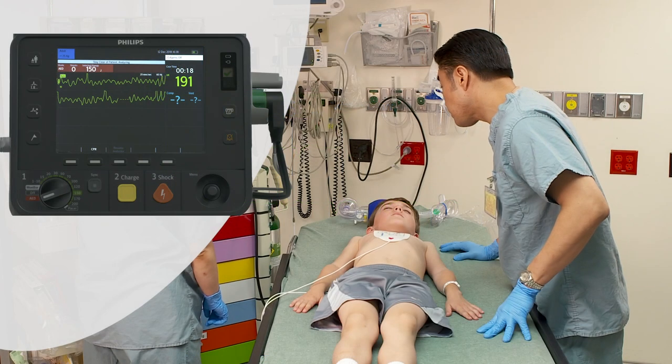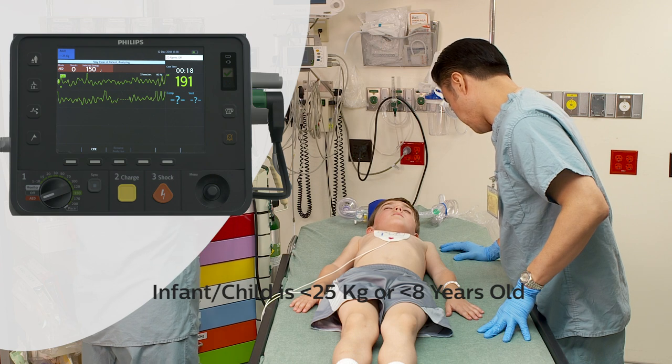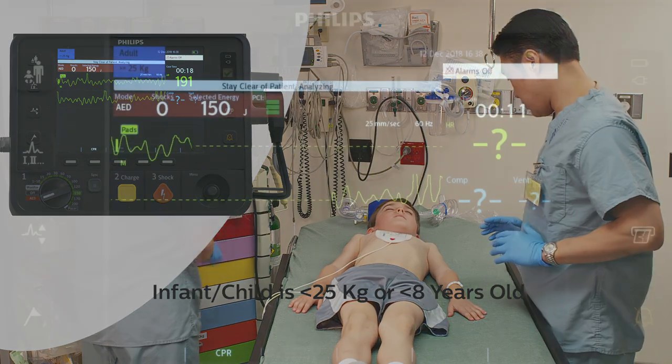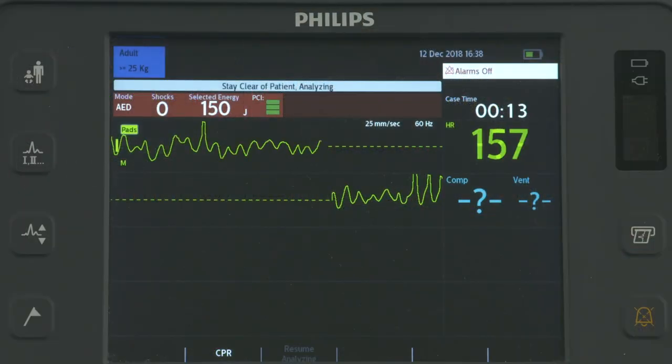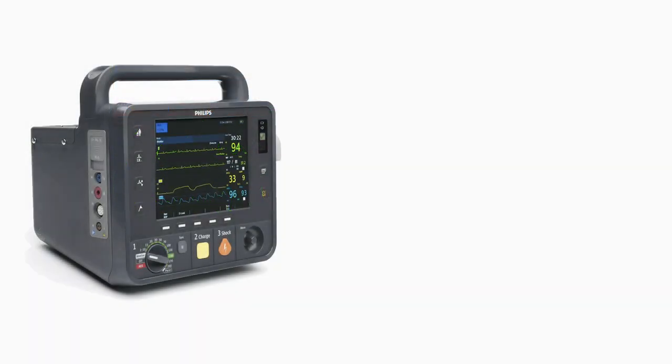In AED mode, the HeartStart Intrepid analyzes the adult and infant-child ECG to determine whether a shock is advised. Using voice prompts, the device guides you through the resuscitation process.